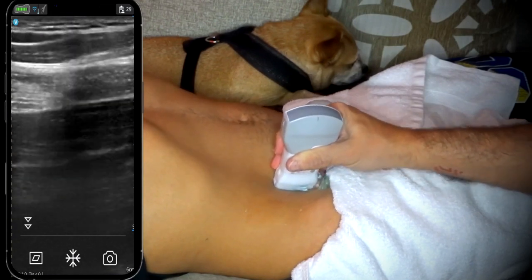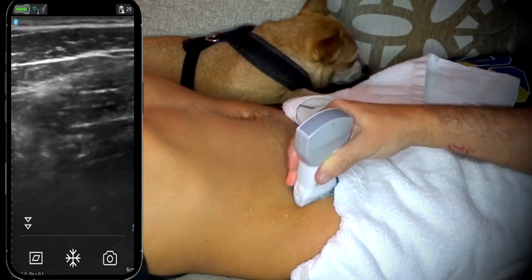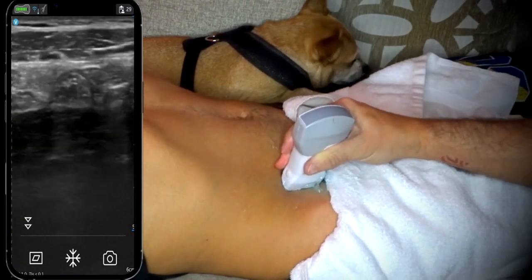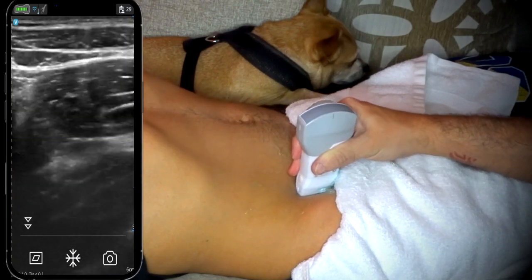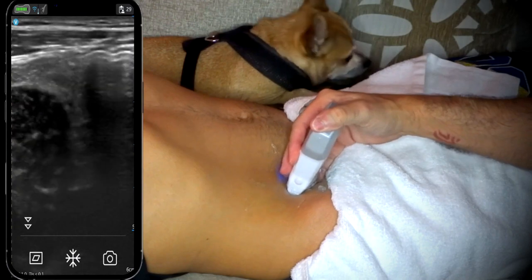Small bowel actually can mimic the appendix. Sometimes you'll see the terminal ileum and it'll look like the appendix. We've had cases of terminal ileitis that mimicked appendicitis, so keep that in mind. And that's pretty much it.